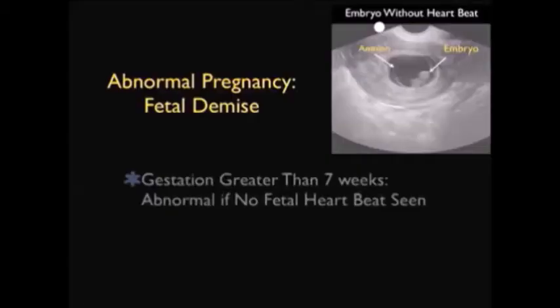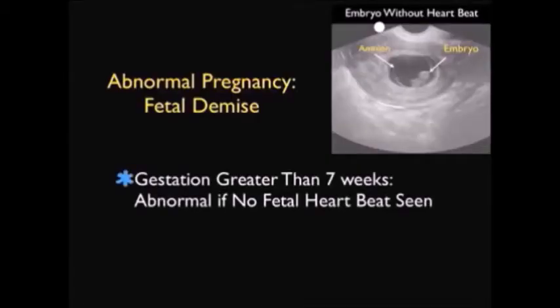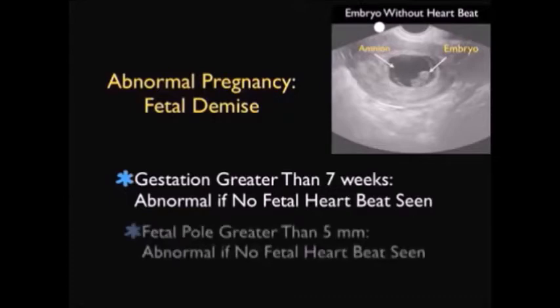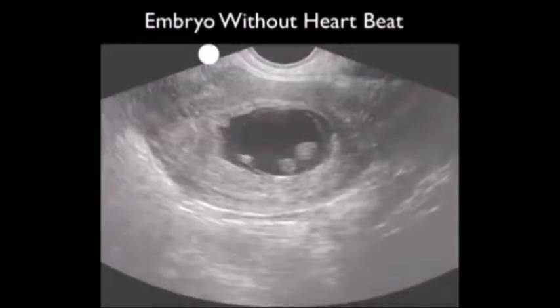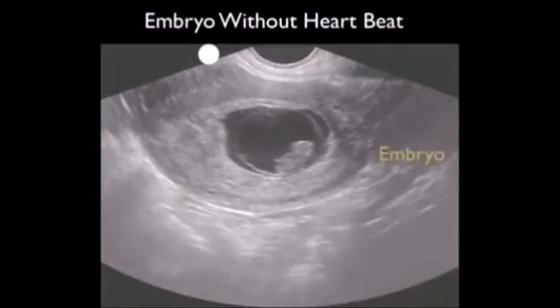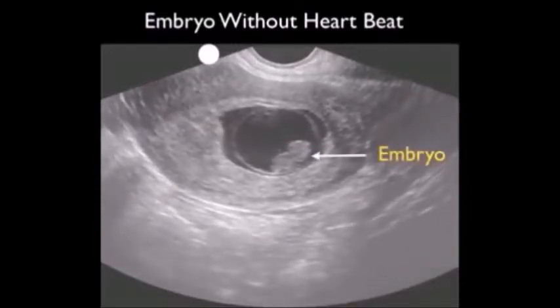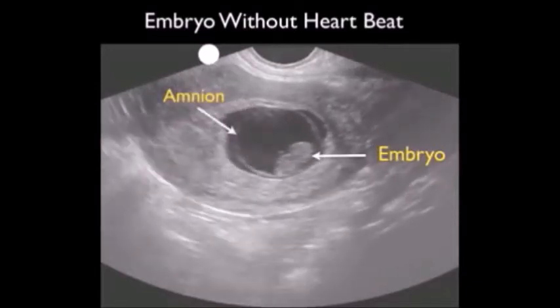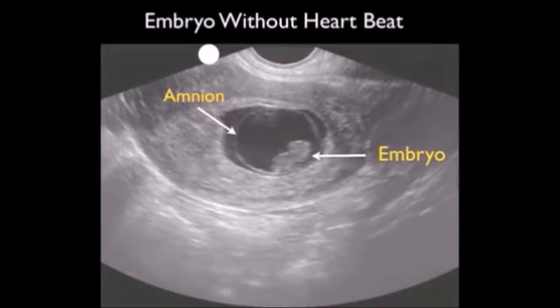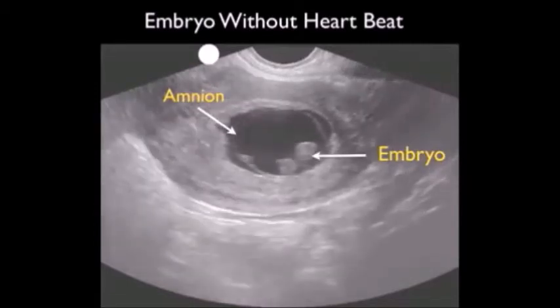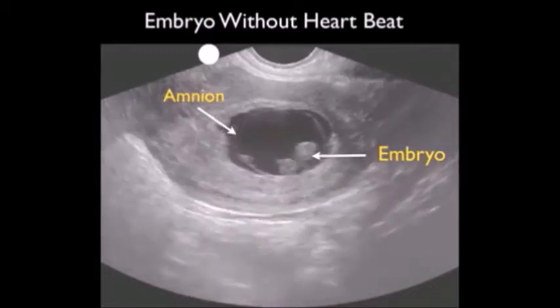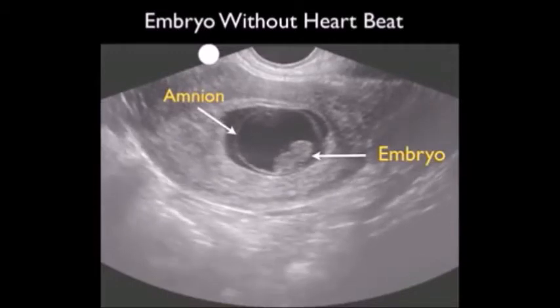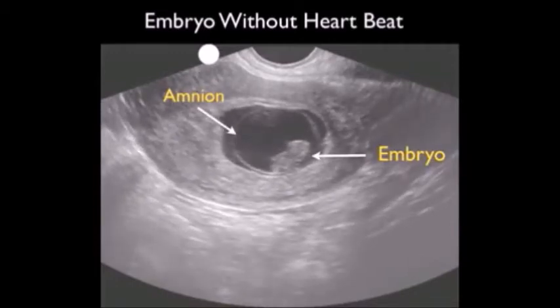Other indicators of an abnormal pregnancy with fetal demise: a gestation greater than 7 weeks is abnormal if no fetal heartbeat is seen, and if the fetal pole is greater than 5 millimeters in dimension, this is abnormal if no fetal heartbeat is seen. This was an unfortunate case in which we see a large fetal pole greater than 5 millimeters without a heartbeat, indicative of embryonic demise. We also see a large circular amnion within the gestational sac. While it's important we're able to pick up the findings of an abnormal pregnancy, I'm always going to get a confirmatory ultrasound and/or OB-GYN consultation before giving the patient the news that there is a fetal demise.